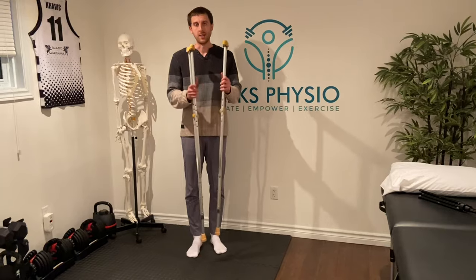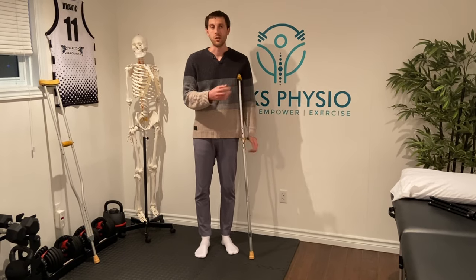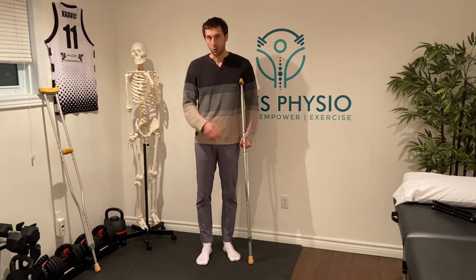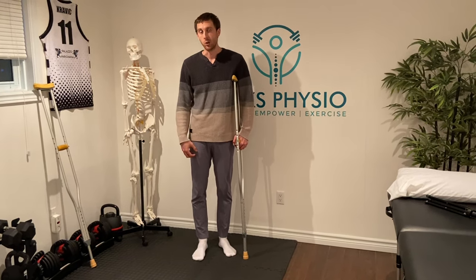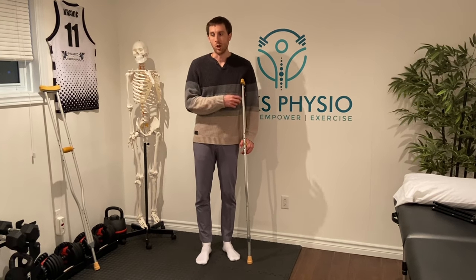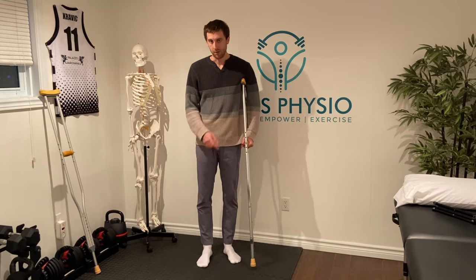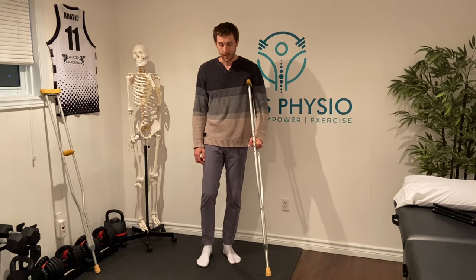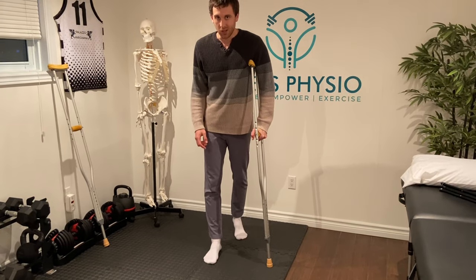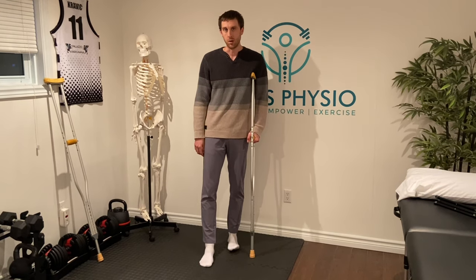As you progress from two crutches to one crutch, you always want to make sure the crutch or cane is on the opposite side from the injured leg. That's going to help take more pressure off that side and shift it toward the non-injured side. A lot of people put the aid on the same side thinking it will help, but that's actually the opposite — always on the opposite leg. When using one aid, bring it forward at the same time you're stepping down with the injured leg, so you're timing it to offload pressure through that leg.